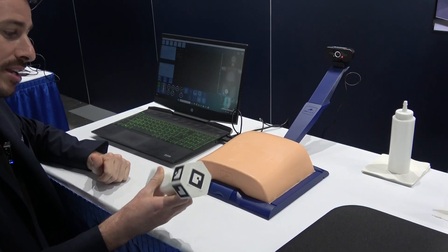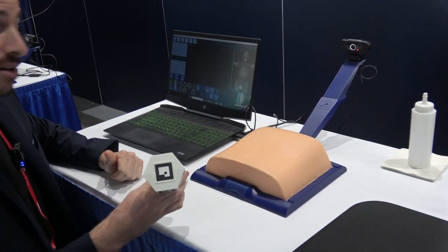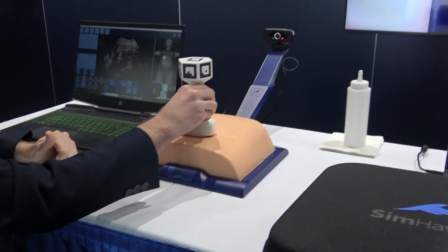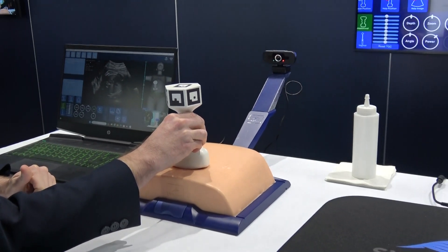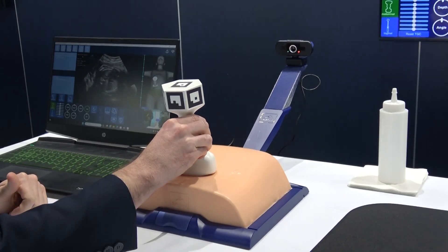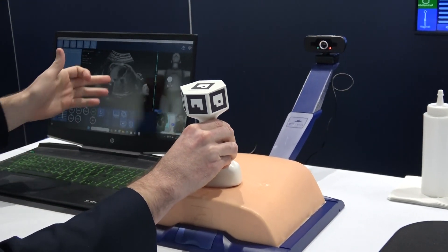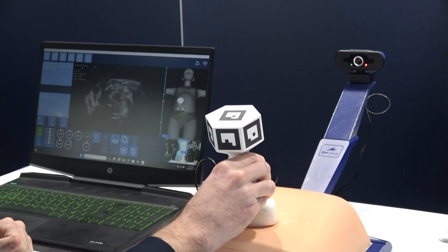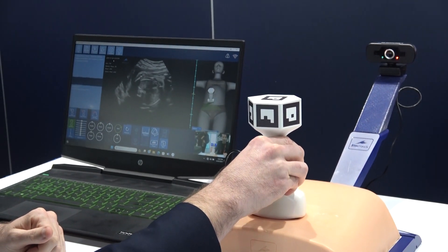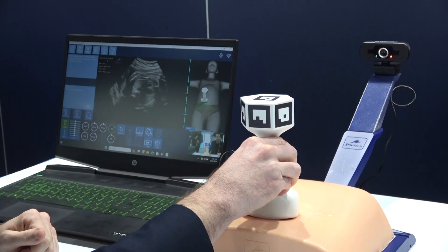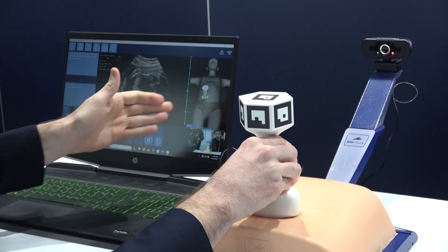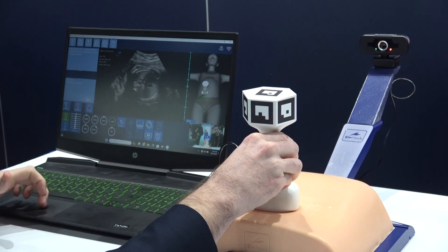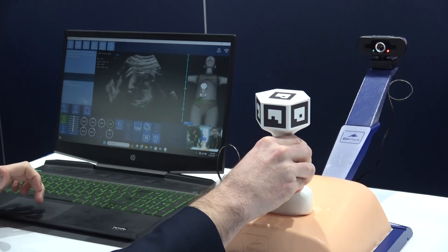As you can see now, when we start training, once I put the transducer, you're actually going to see on the screen the ultrasound itself. On the right, you will see the virtual dummy with a probe.